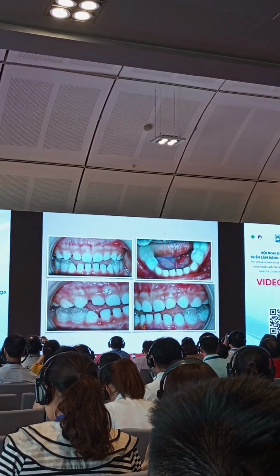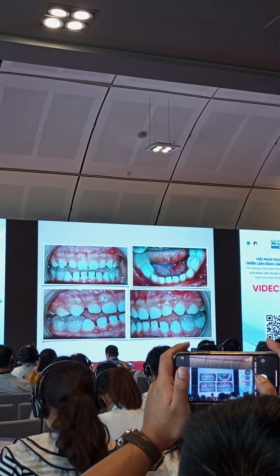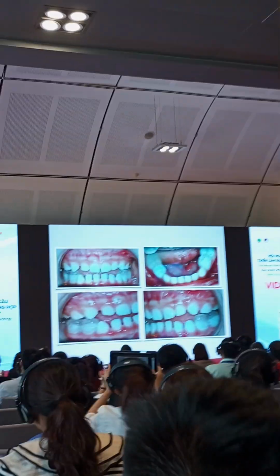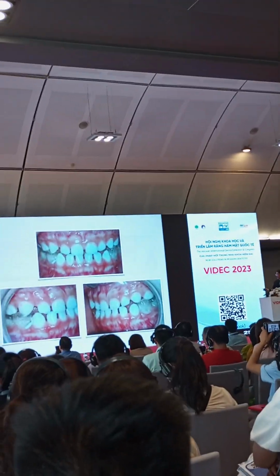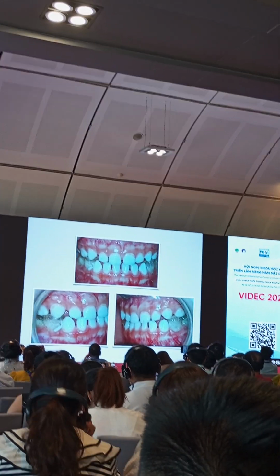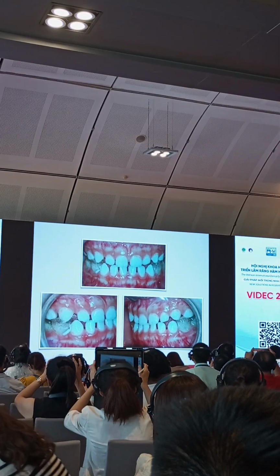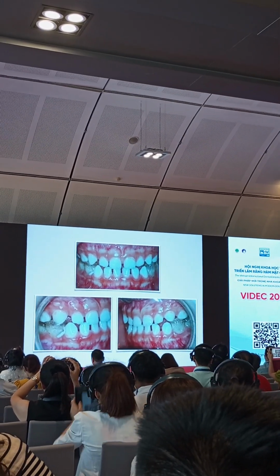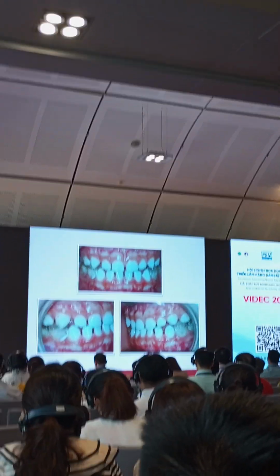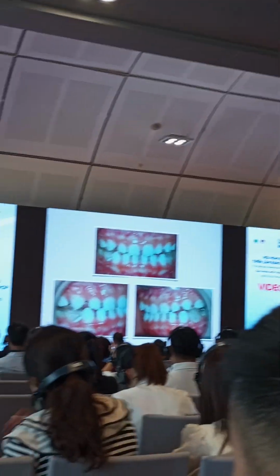When the patient comes back, I install the overdenture and let the patient go home. When the patient came back after 2 months, without doing anything else, just with the overdenture, you can see now that the mandible moved a little bit backward, and we now get positive overjet and overbite.